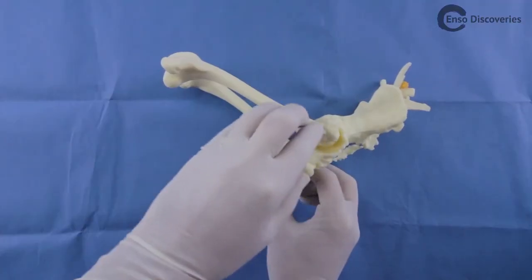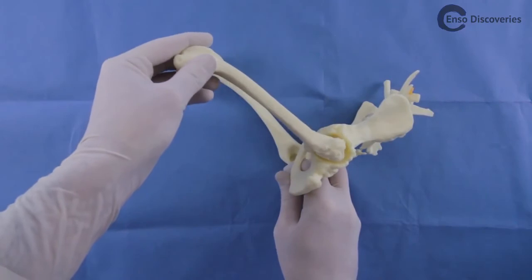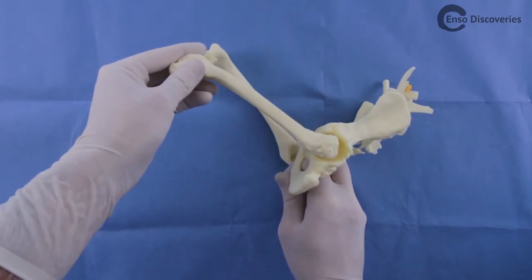Once you have found the end of the trochanter, have your assistant gently lower the stifle. The joint capsule extends from the acetabular rim to the end of the articular cartilage. In a 40-pound dog, this space may be half a centimeter wide when the femur is parallel to the table. By simply lowering the stifle, you may double the size of your target.